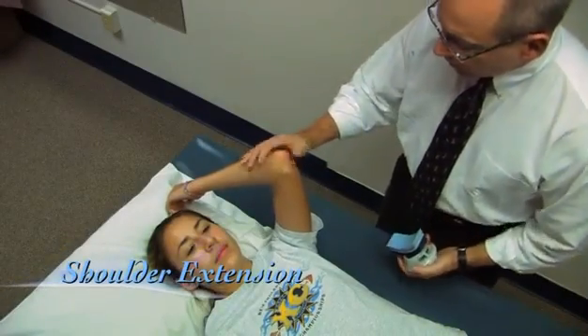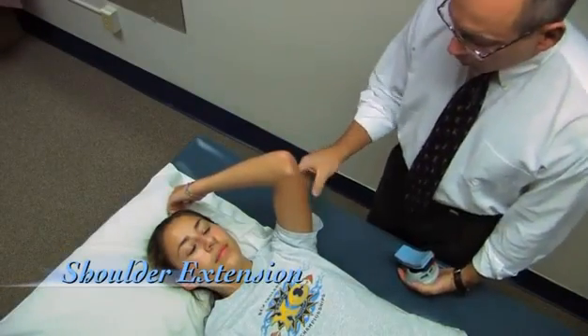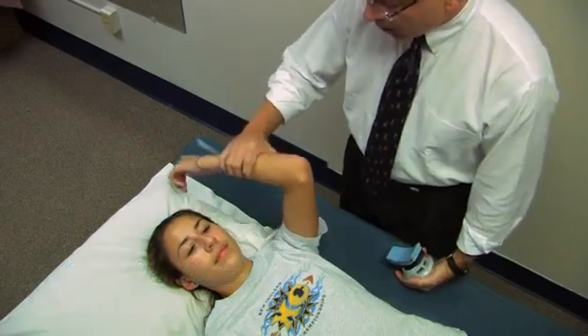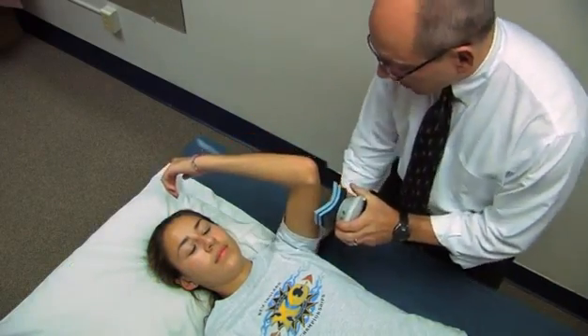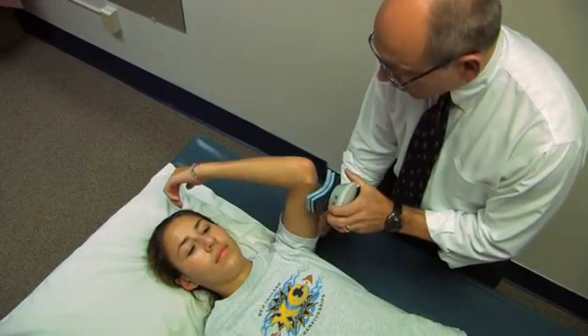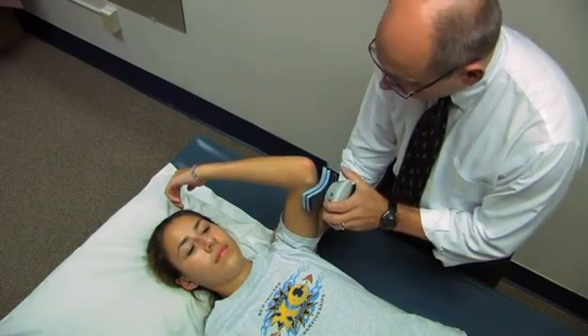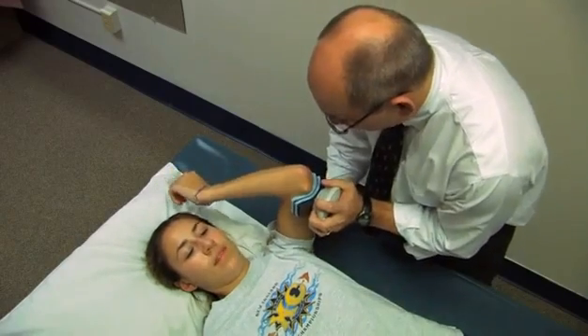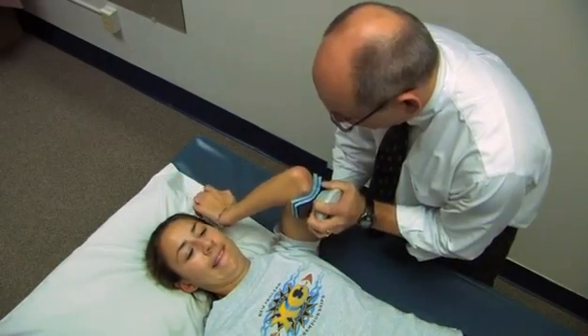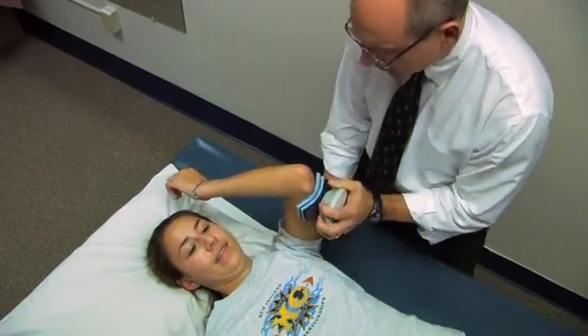Now we're going to measure shoulder extension. Again, the shoulder is at 90 degrees. We're going to allow the elbow to flex. I'm going to place the device just proximal to the elbow. Stabilize here. When I say go, take a second or two to come to your maximum effort, then drive your arm down as hard as you can. Go ahead — harder, harder. And relax. Good job.